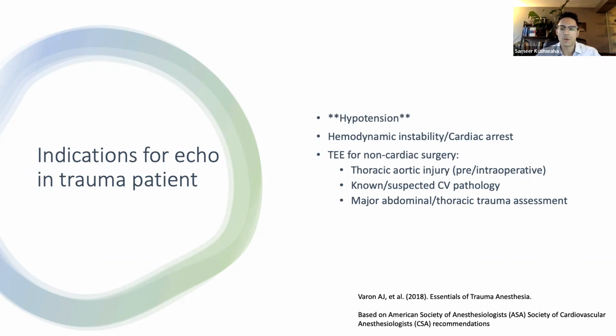It can be used in patients who are at high risk for myocardial ischemia, again for hemodynamic monitoring, and in patients with unexplained hypotension or persistent hypoxia, or in other patients who have not clearly sustained a cardiac injury, but have had major injuries to their abdominal area or to their thorax.